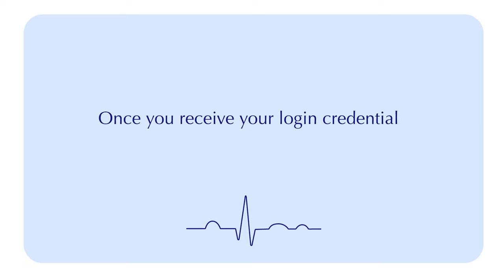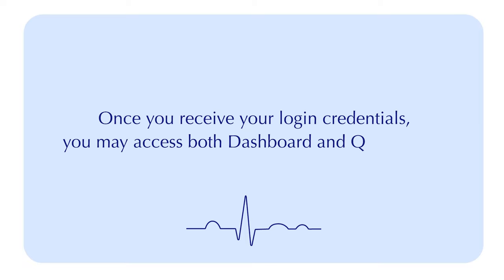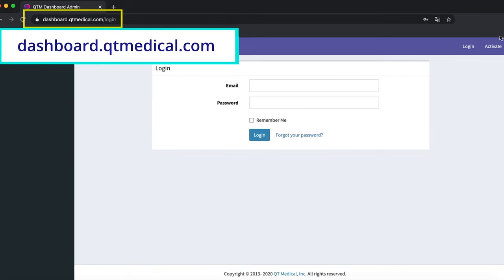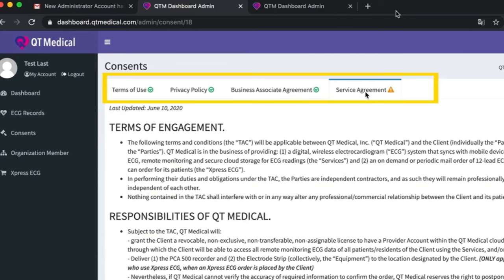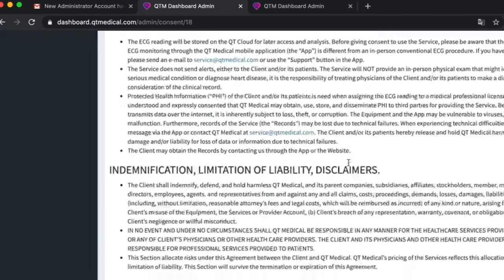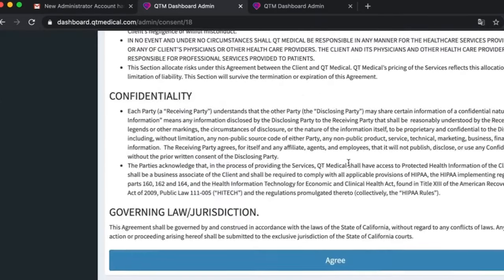Once you receive your login credentials, you may access both the dashboard and QtECG app. To access the dashboard, go to dashboard.qtmedical.com, log in and enter your username and password. Browse through the privacy policy, business associate agreement, terms of use, and service agreement, then accept the agreements.